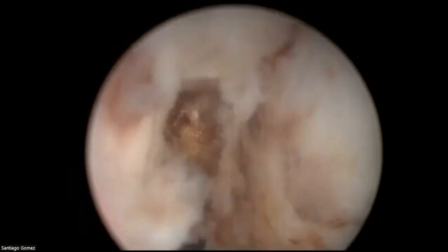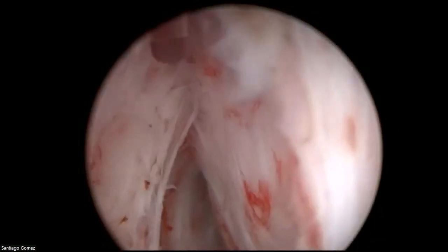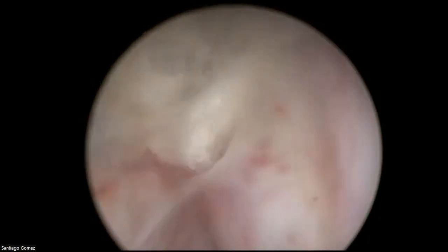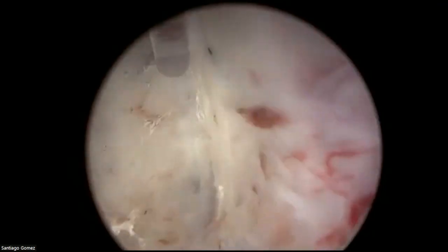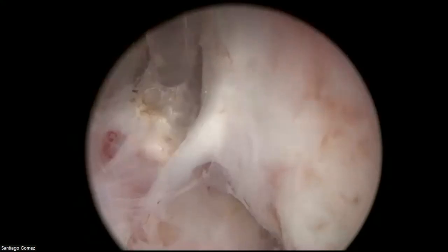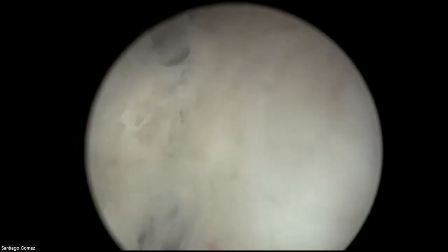So here I'm going to try to start developing the lateral aspects. This is the posterior, this is the lateral, and I will be very, very careful at the beginning not to push up too much, just some millimeters, 4, 5, 6 millimeters like this, and I will take this dissection deeper towards the bladder neck. The idea is to try to reach, let's say, probably a similar depth as we did posteriorly.